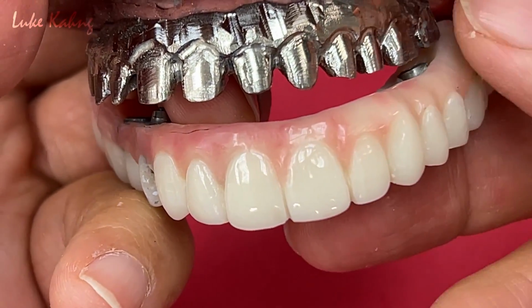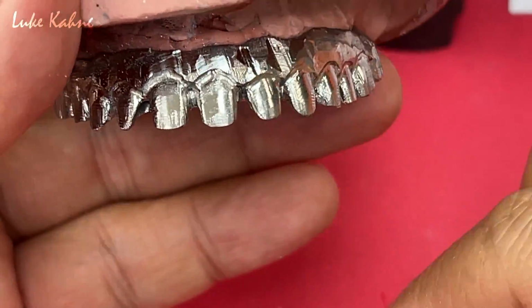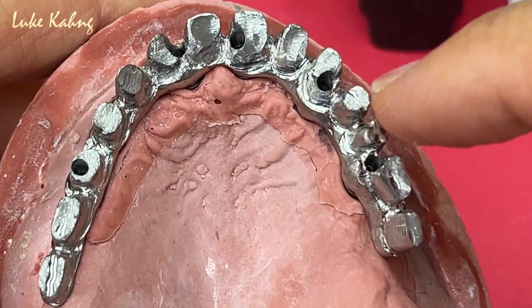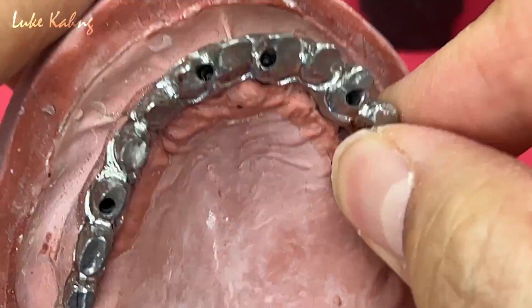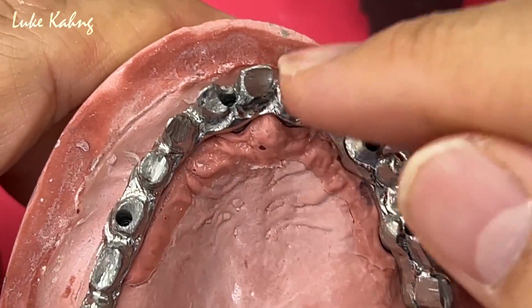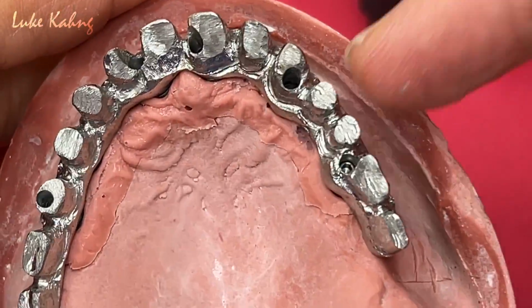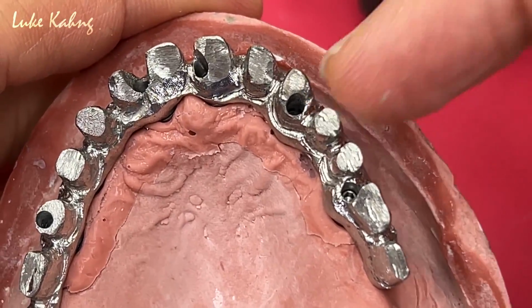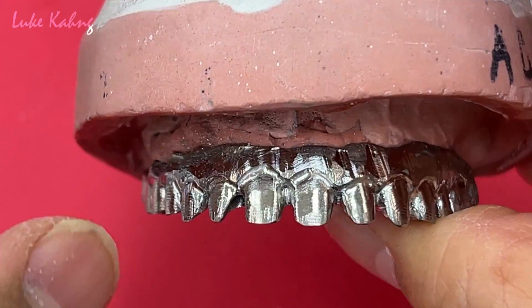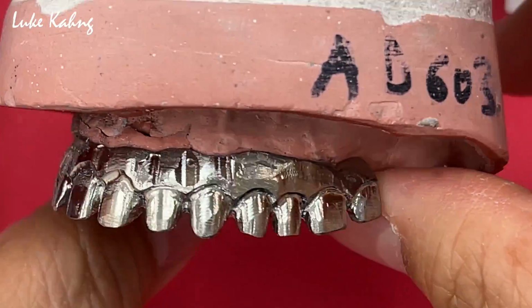Now, so finally finished the metal framework. It's very expensive jewelry because we're using the semi-precious metals, around $2,000, a little bit more than 1 ounce. And then we also ordered the Zimmer UCLA gold, another extra $1,400. So it itself is already $3,400, which is a very expensive frame. I'm not talking about the labor, okay? If labor is added, it's more than $4,000.